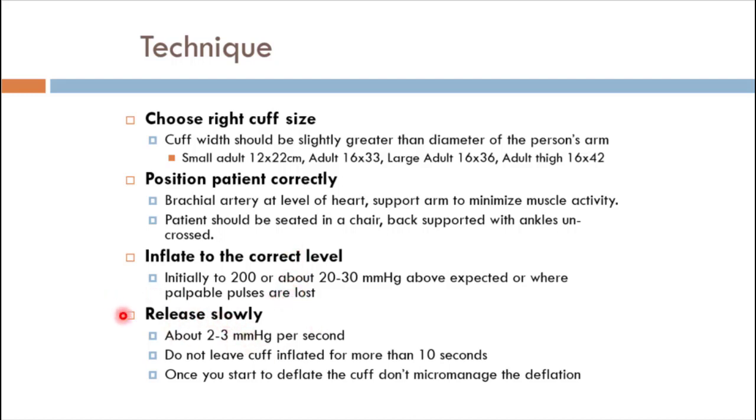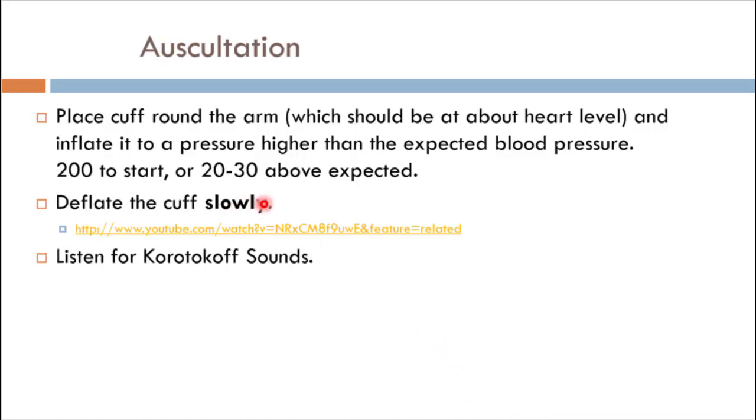And then this is the biggest aspect here. I have a couple YouTube videos posted through Blackboard that can show you the speed at which you should be doing this. You want to release this pretty slowly. Again, you want to try to have your complete reading done within 10 seconds, but you don't want to go super fast and do it in 2 seconds or you'll miss it. So as you see the video and you play around, you can see that it's not too slow and not too fast.